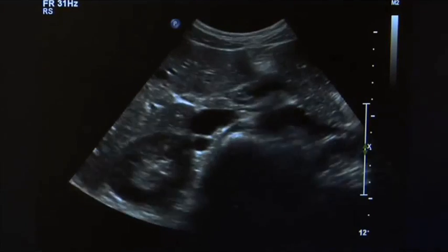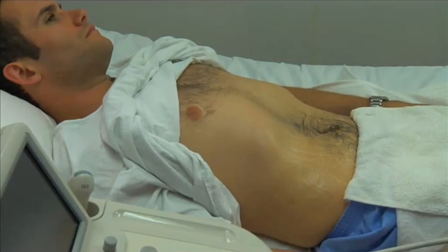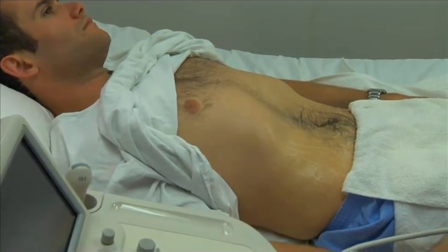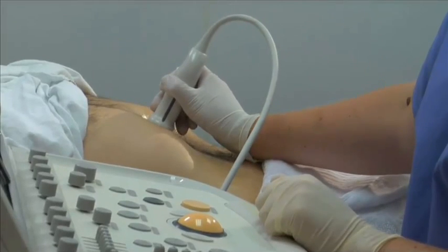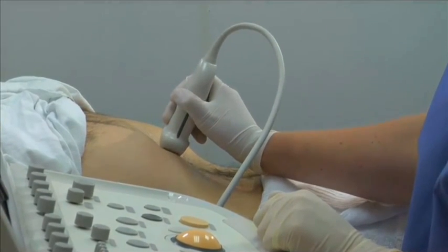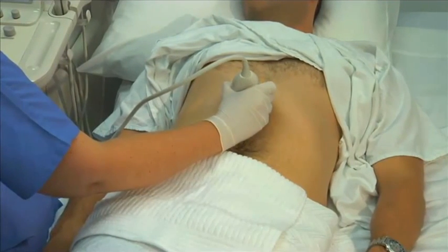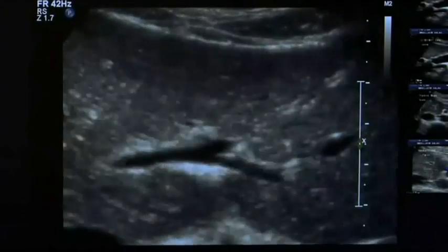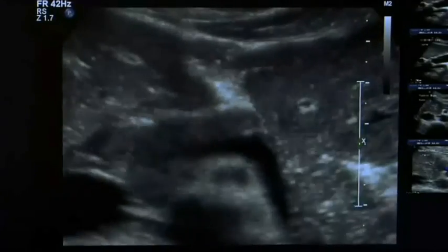Once the survey is complete, begin the pancreas scan. Select the appropriate transducer position. The most useful position for imaging the pancreas is the epigastric approach. Place the transducer inferior to the subcostal margin in the epigastric region, in the midline of the abdomen, at the level of the xiphoid. Ask the patient to take in a deep breath and hold it, as this displaces the liver downwards and improves the acoustic window.